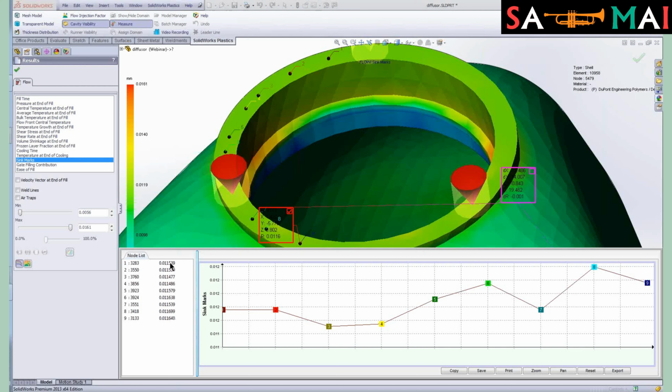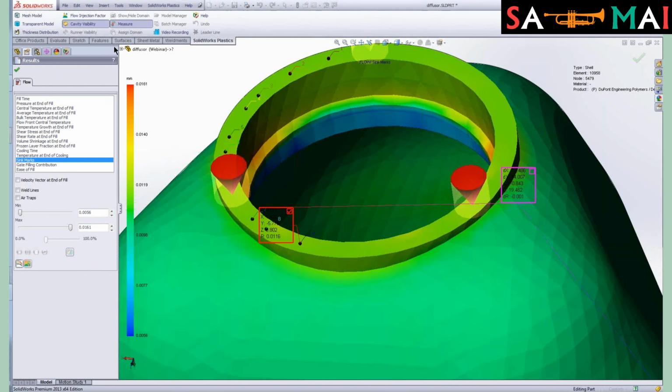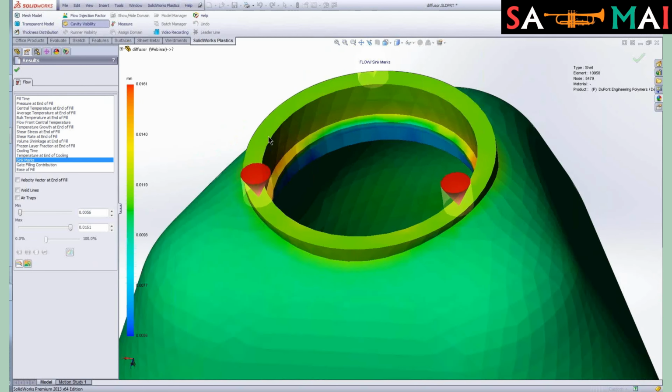Now we can take this data, give it to our QA department, and this is what we could roughly expect from that part. So if you were concerned about variation of more than about 5/10 thousandths of an inch, that might be something to know in advance. Of course, this is a fairly simple part, so it's not going to vary that much. Let's go ahead and turn that off and turn off our measure tool.